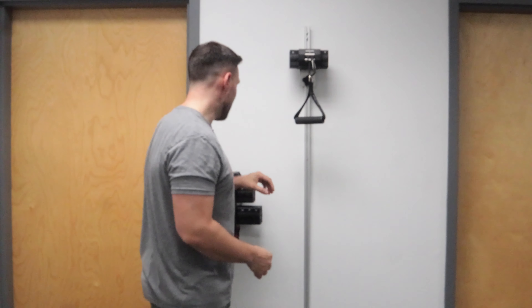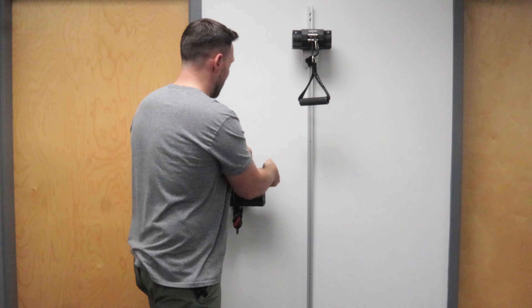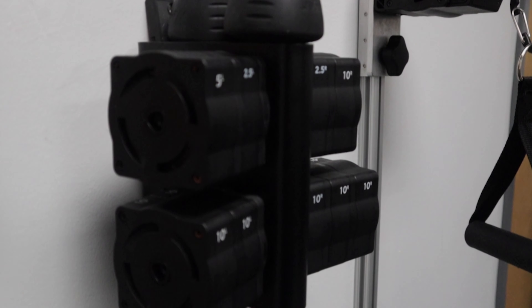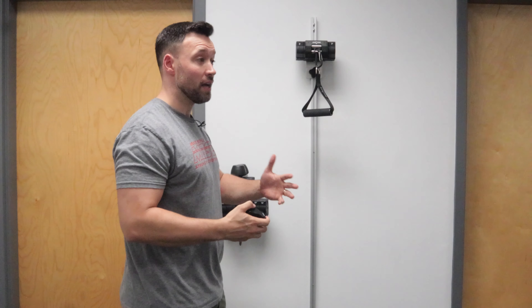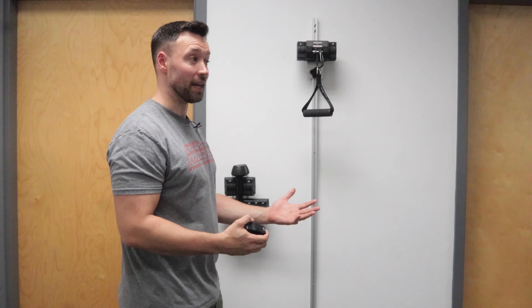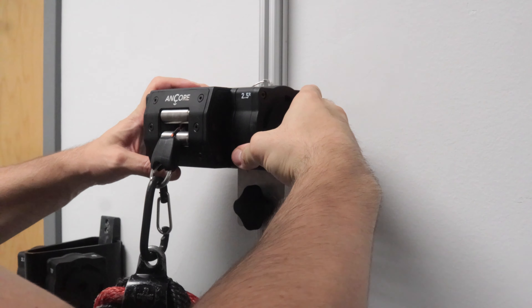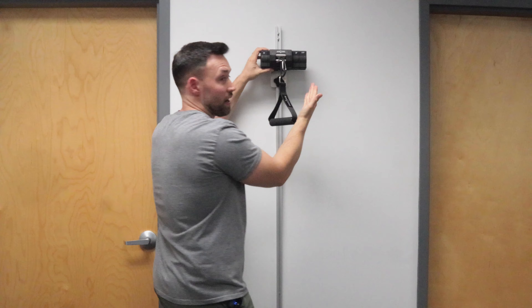It's real adjustable — we can slide it really easy to put the weights on and off. You have everything as low as two and a half pounds, five pounds, ten pounds. So if someone's not that strong or injured, you can find the right resistance for them, especially in a rehab setting. Super easy to put on — snap it on, two and a half pounds on. Want to take them off, take them off.